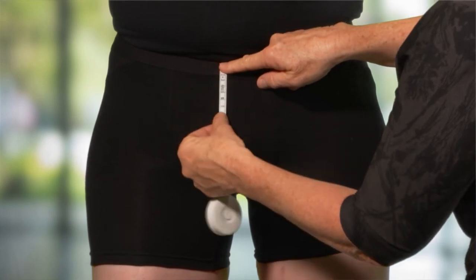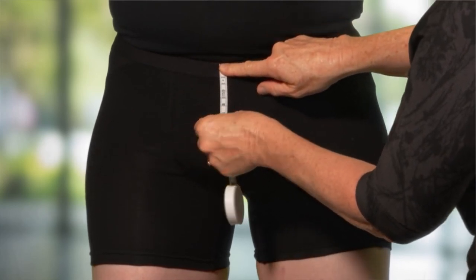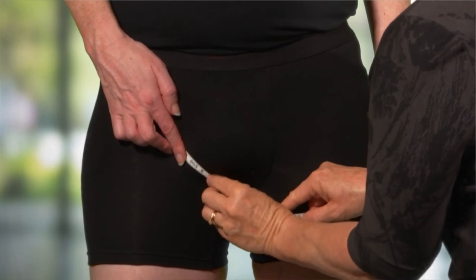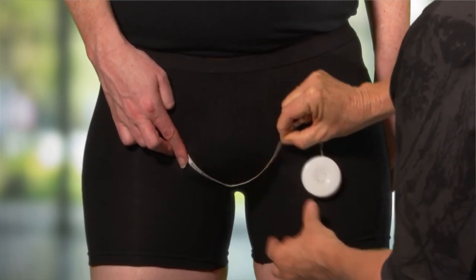A linear measurement is then taken from this point to the base, which is the top of the penis. A contour measurement is required around the scrotum from a point approximating the inguinal ligament on one side to the same on the other.